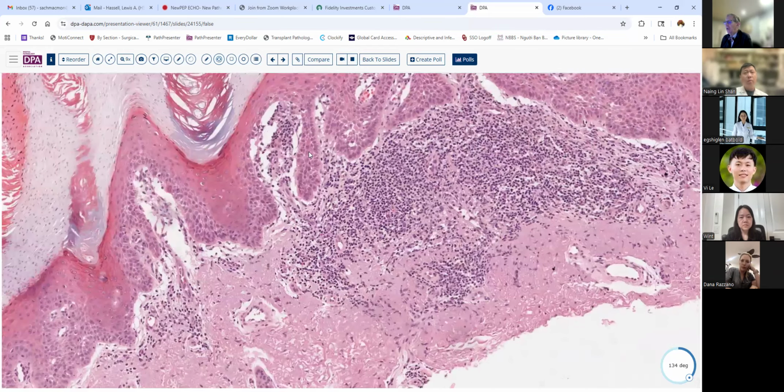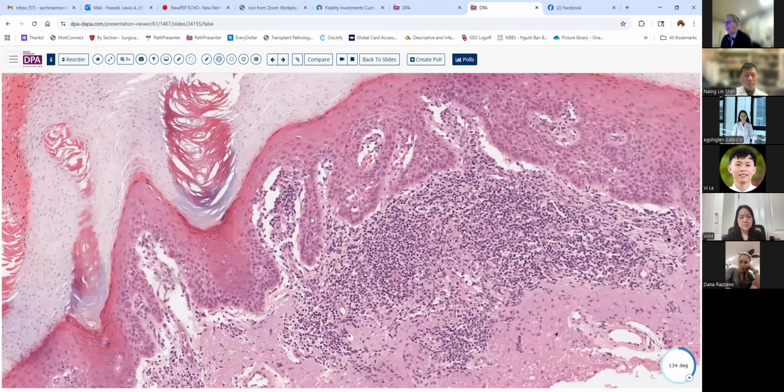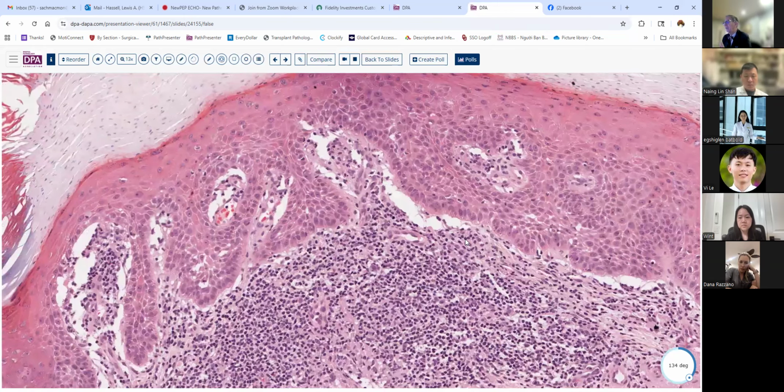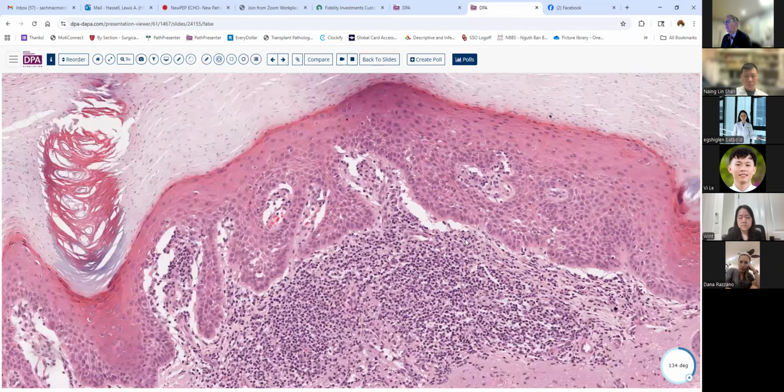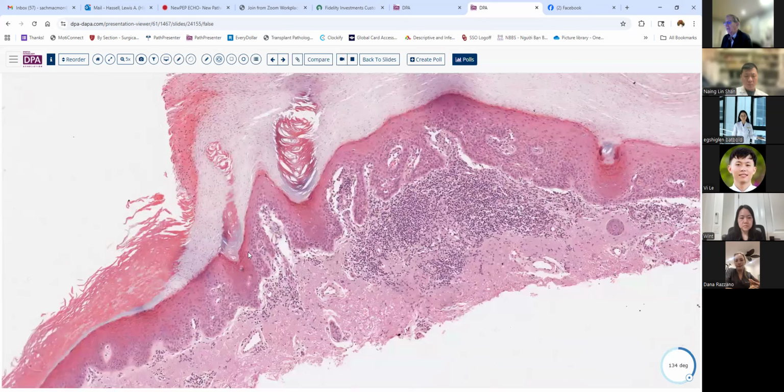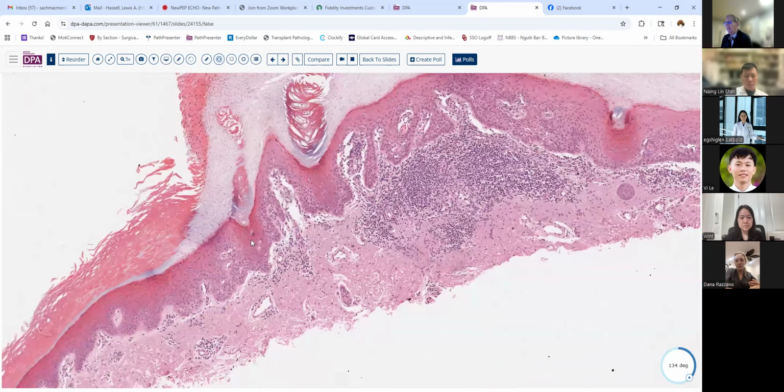But whether you use that term or a term like actinic keratosis with basal proliferation, or hypertrophic actinic keratosis with basal proliferation, this is a significant thing to communicate, because it does say that this was a little bit further along in terms of its development and potential invasiveness.